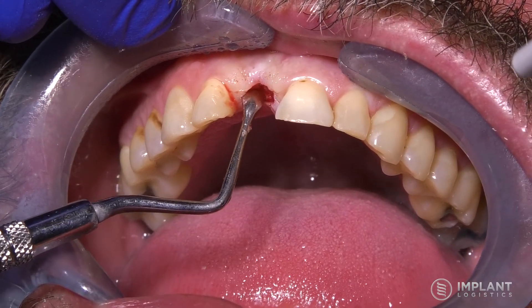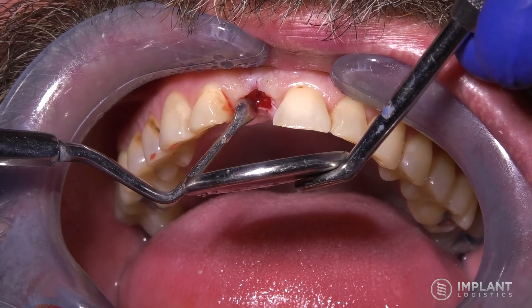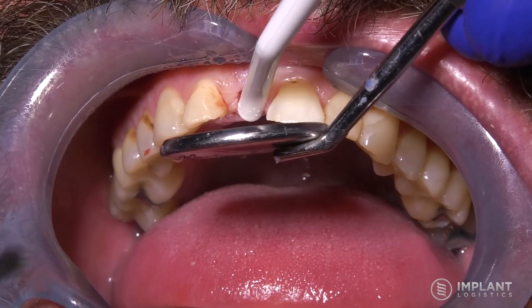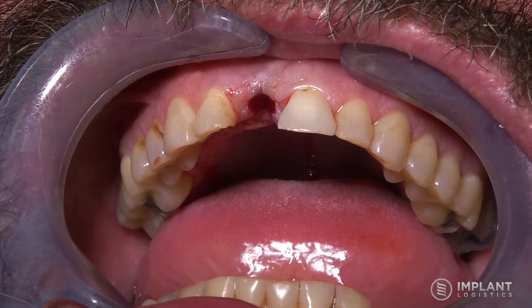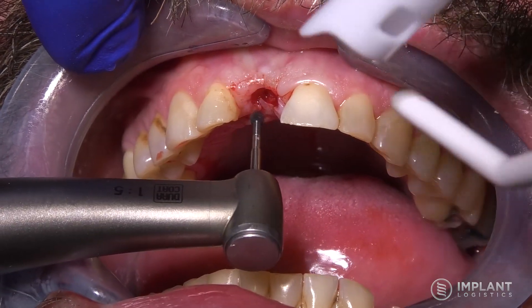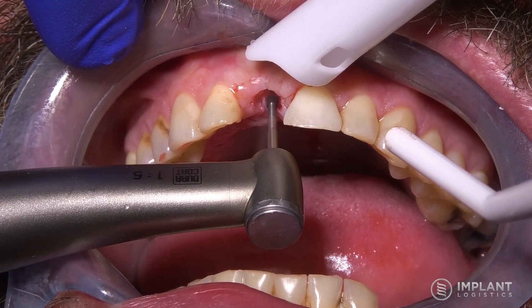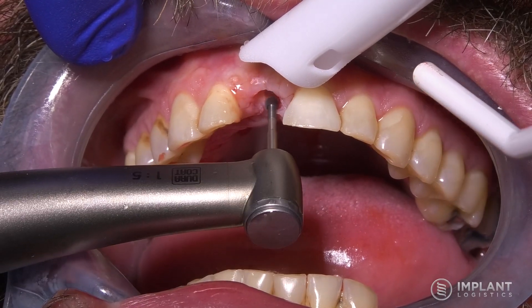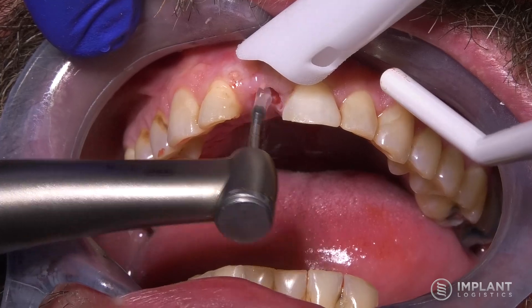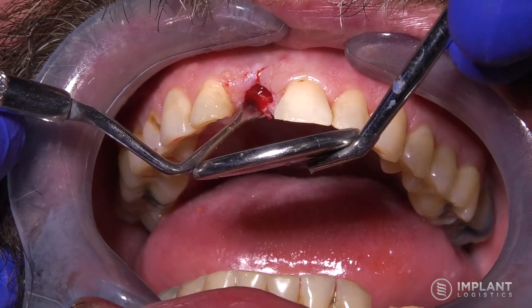Once the tissue is removed, the next thing you would determine is whether the implant is exposed or whether the bone has grown over the top of the implant. So you have a subcrustally placed implant with a good healing response, and now the implant will have to be exposed in order to take the final impression. I generally use a high-speed handpiece with a lot of irrigation to take off the bone over the top of the implant, doing this quite carefully.